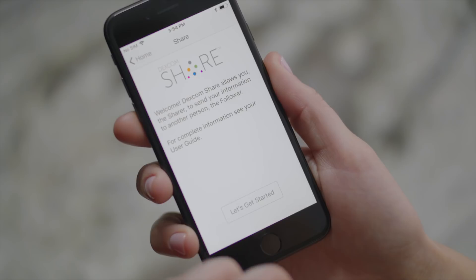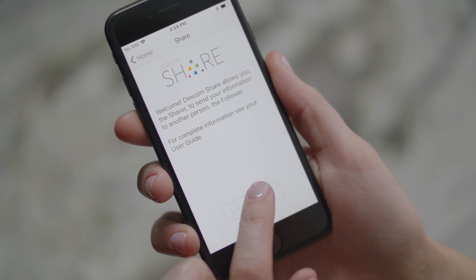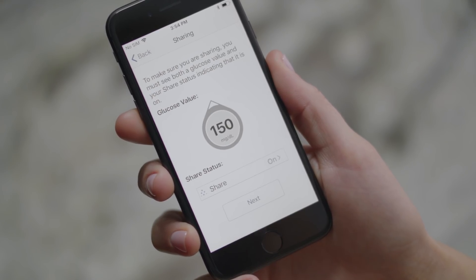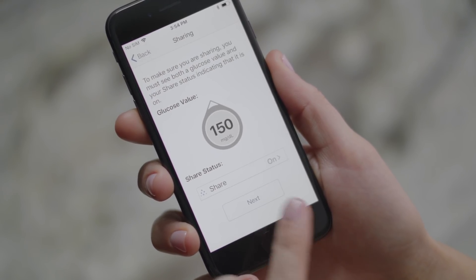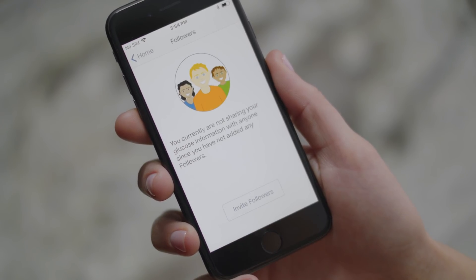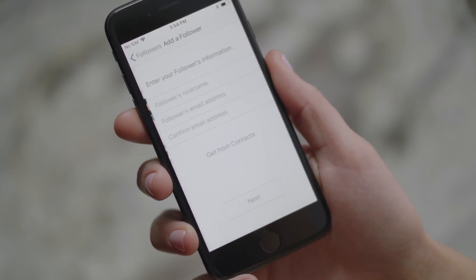The app will walk you through information screens and inviting followers. Add a follower by entering their email address.